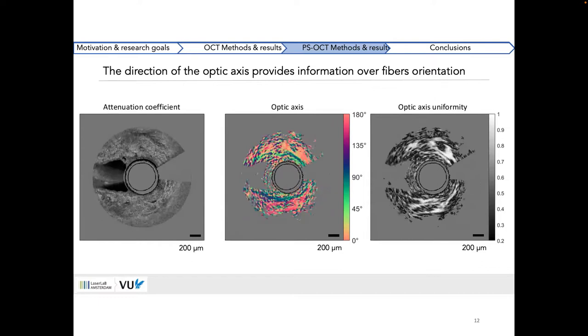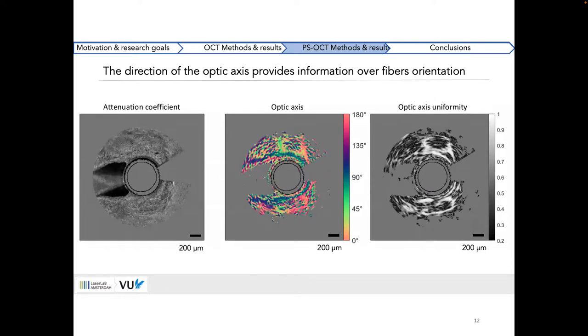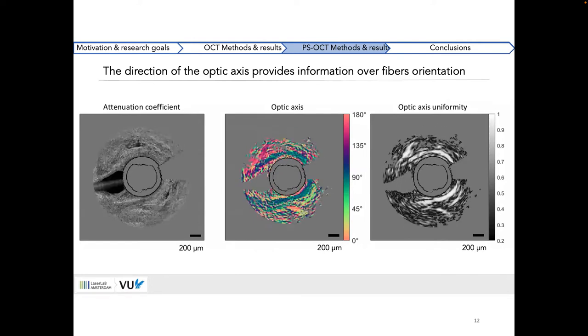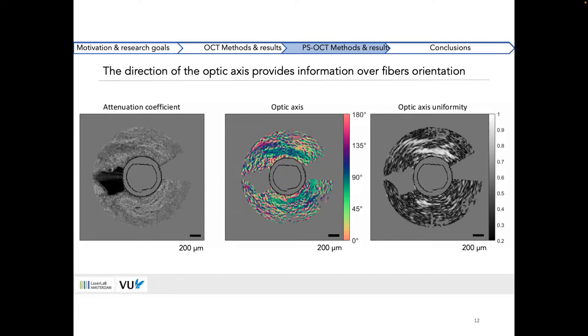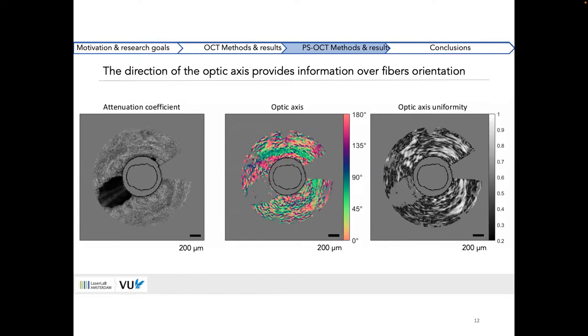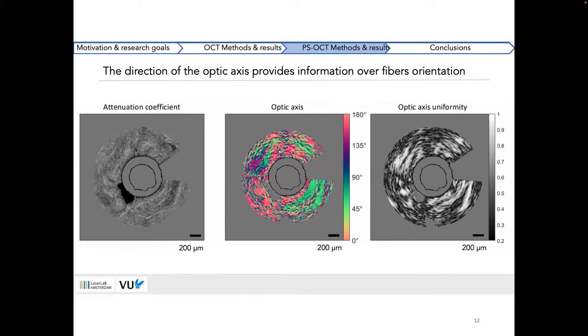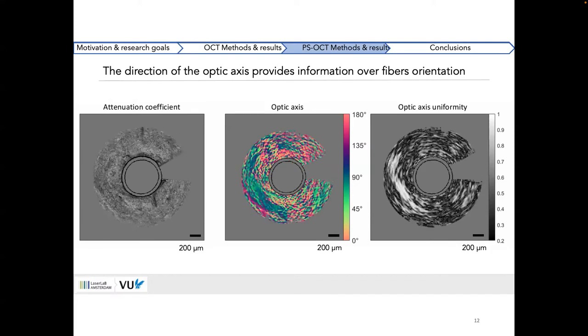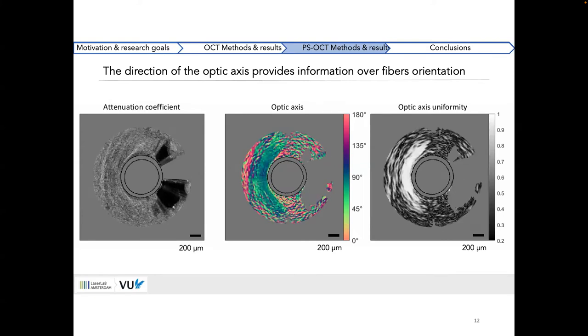And let me see. First, the movie. Maybe this purple is the one that's oriented around. I think maybe this is older, and at that point we had not established the color coding yet, but the orange is, of course, way better to illustrate the smooth muscle versus green. I think in this one it's the greenish that is oriented like this, but in our latest processing it's this color. It looks much more natural, like it's smooth muscle, right? You might make it smooth muscle red.